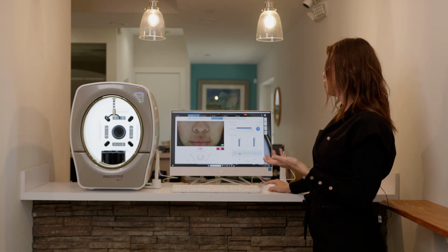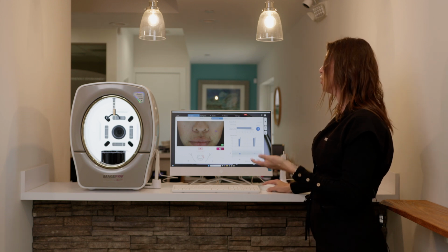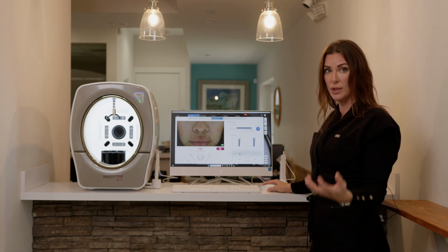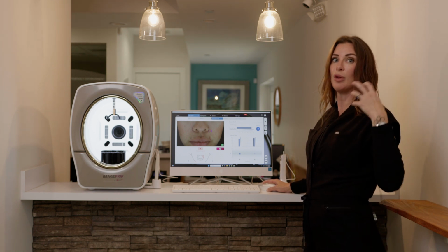Nasolabial folds. She's -2, so meaning she's 2 better off than those of her average age group. Not necessarily something we need to address on her. However, if this was an issue and you're an injector, we know that mid-face fill is going to help lift that.